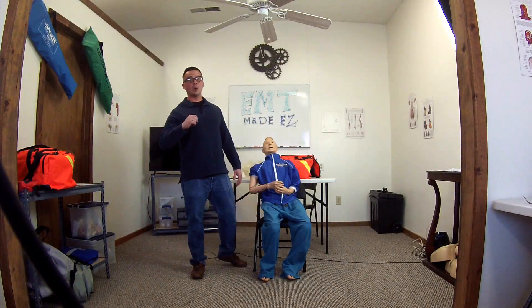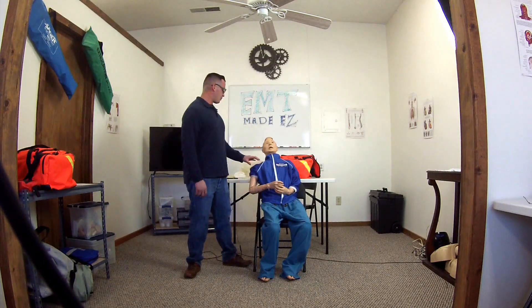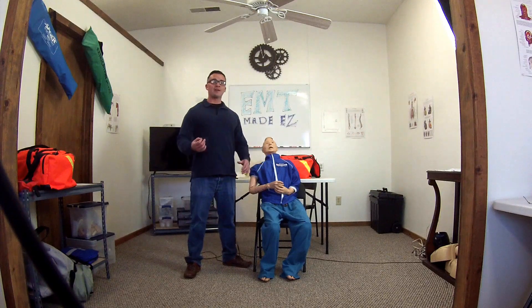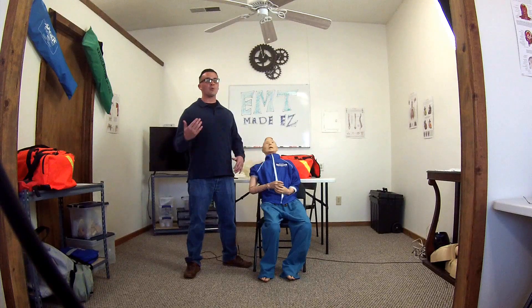Hey guys, in this video I am going over joint immobilization of the shoulder — the right shoulder for this video. In your NREMT skills, when you get a joint injury, it tends to be the shoulder, so that's why I'm going to cover that.